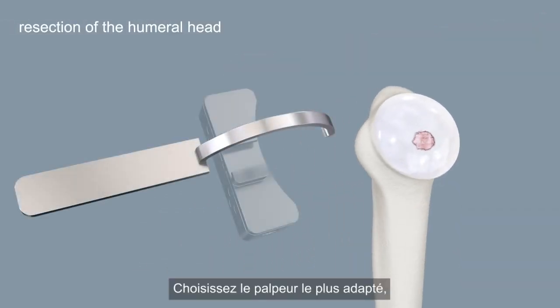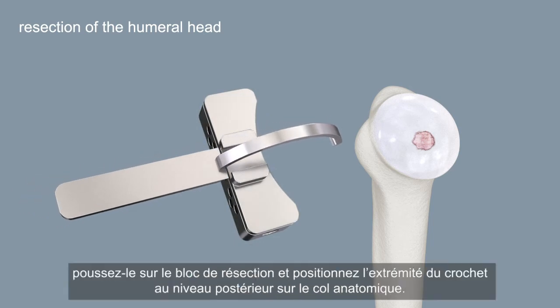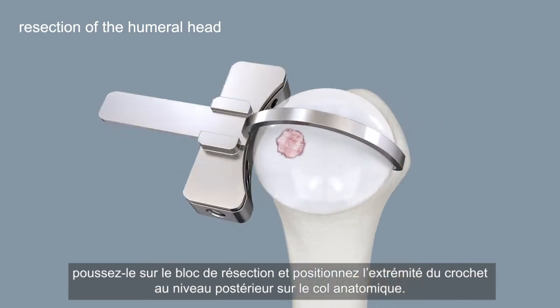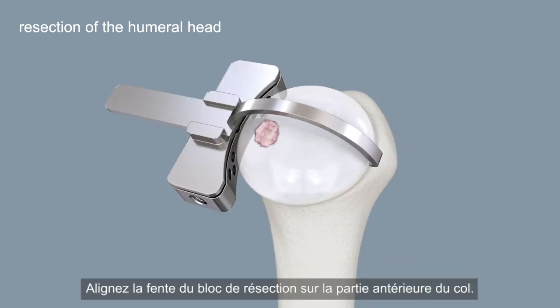Select the best fitting adjustment arm. Slide it onto the cutting block and position the tip of the hook posteriorly on the anatomical neck. Align the slot of the cutting block with the anterior neck.